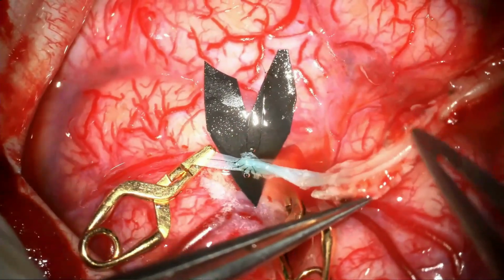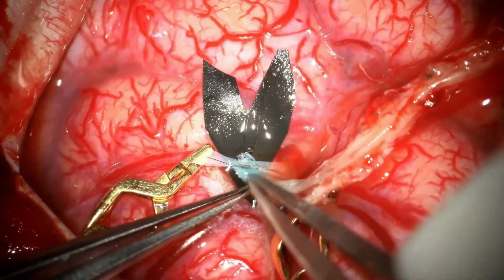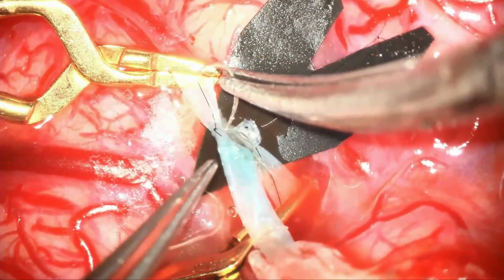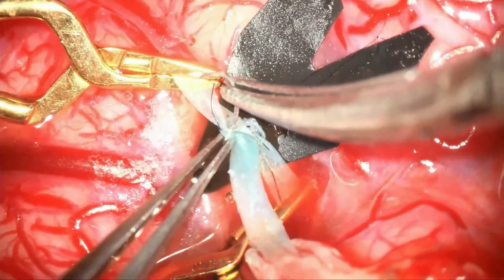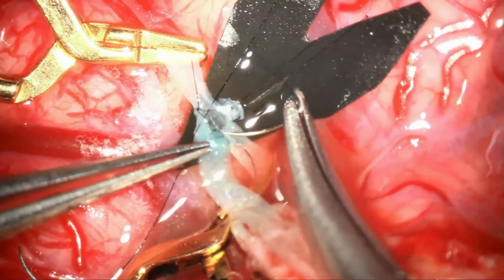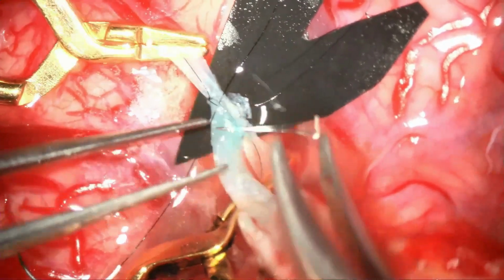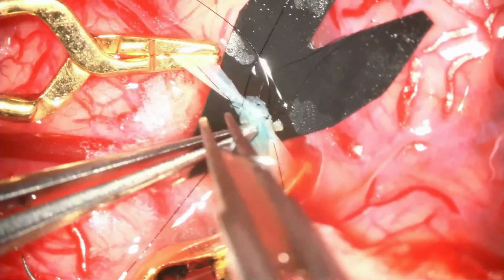The STA is now turned to the other side to expose the arteriotomy flap side. The surgeon needs to change the position of the chair with respect to the head before starting the other side suturing. Two sutures are taken first on either side of the flap. We can observe that the black background is not hindering the view of the black suture material. Moreover, it provides the best possible contrast against the unstained MCA.